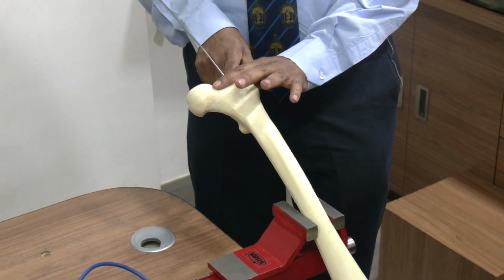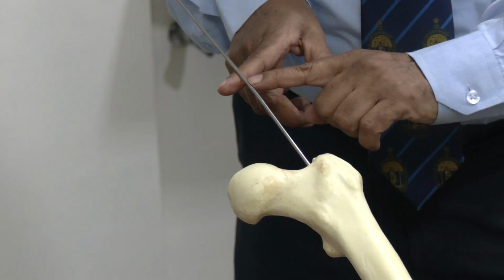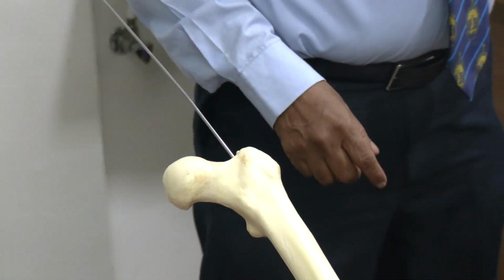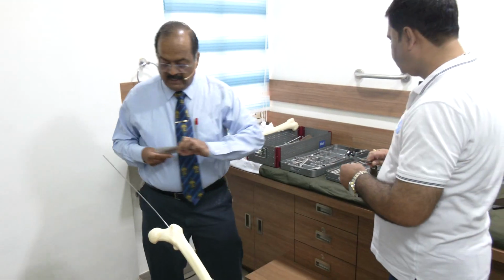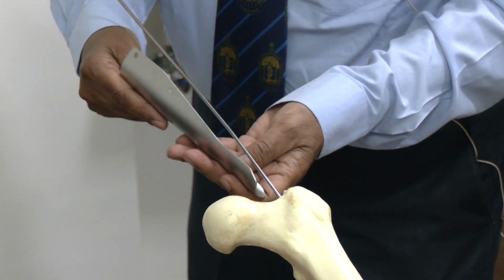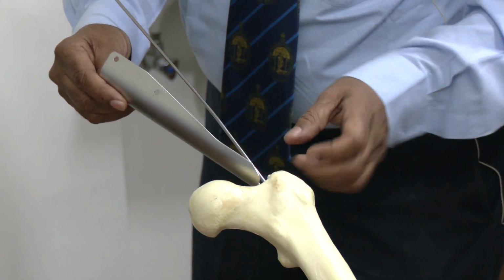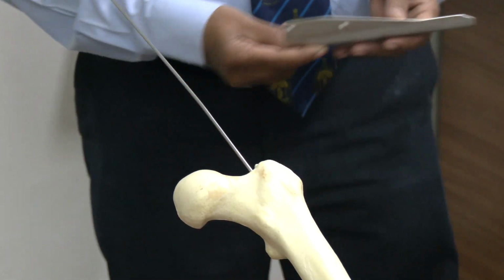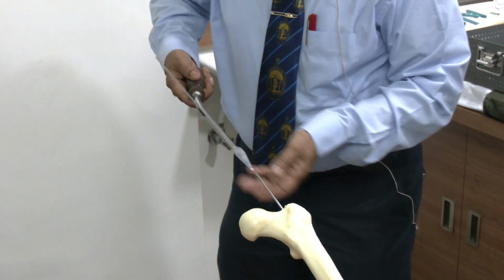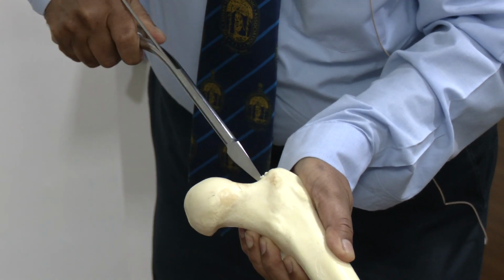Now once I have done this, what I normally do is I take an incision over this guide wire where I have inserted and enlarge this entry. For enlarging this entry, first we have to use a tissue protector. Wherever the incision we have taken, this tissue protector prevents the friction burns from the instrument which we are using subsequently. I don't want to use this instrument now because we are doing it on a bone model. Then over this we can use the sharp awl and enlarge the size of the hole.